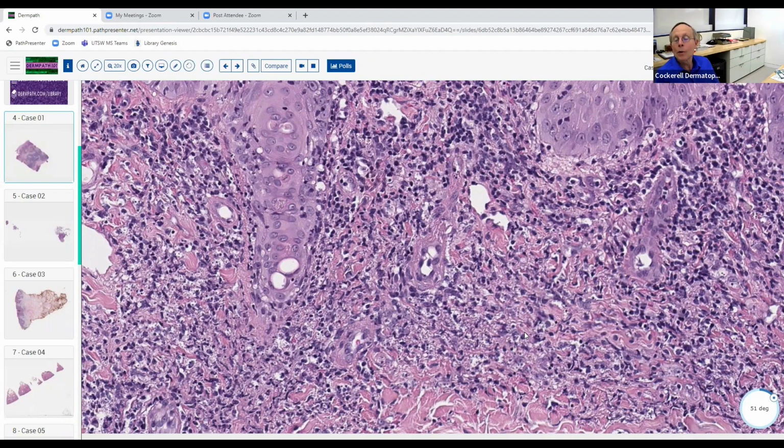They probably would give you a special stain, or they might give you some more information about the slide or something like that. But the most important thing is, number one, recognizing the pattern of inflammation, which you did quite nicely, recognizing that it's probably an infection based on that dense diffuse infiltrate with granulomatous features, remembering the patterns of granulomatous inflammation, because different diseases tend to give different patterns there.